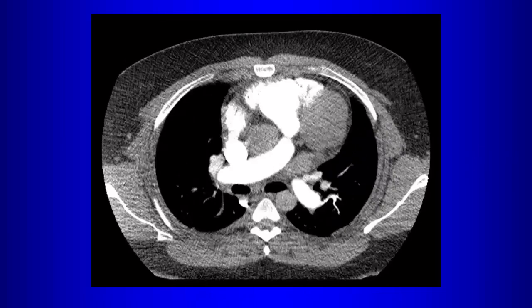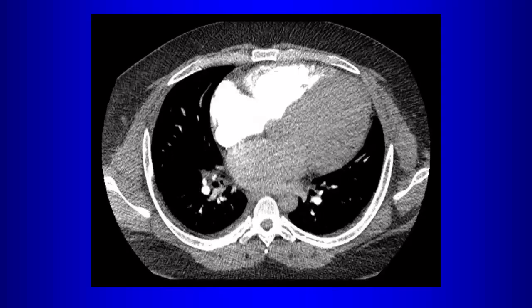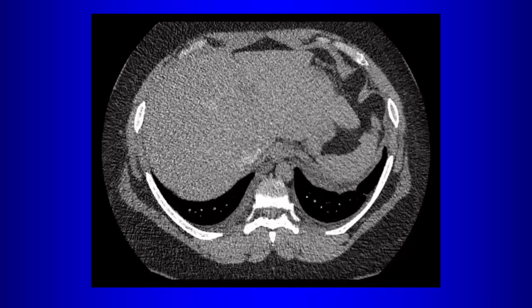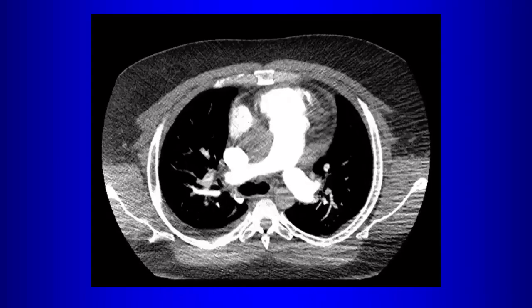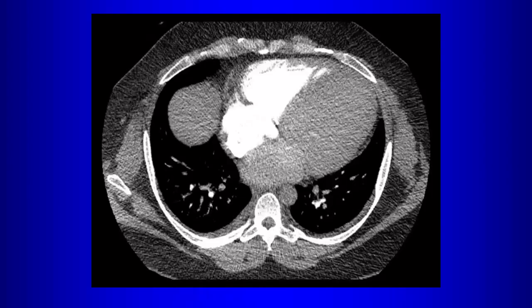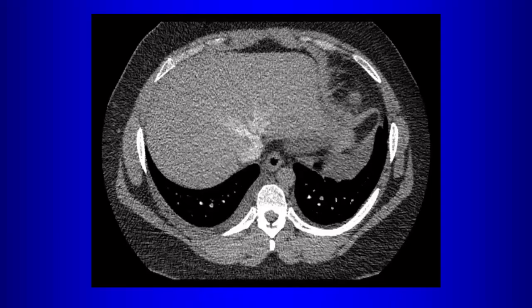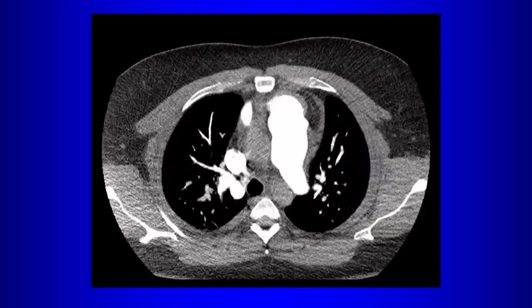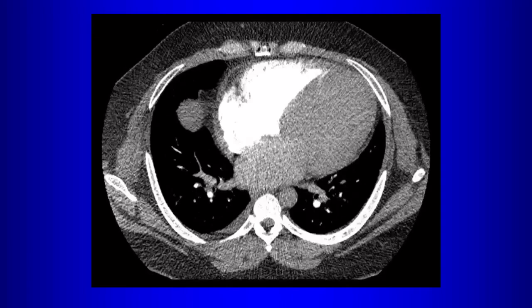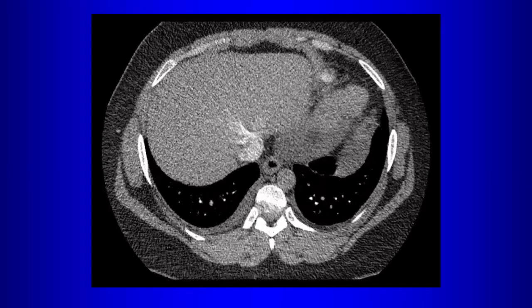Smart prep. So how does it work? You select a vessel of interest. That's how you differentiate when you're going to time the scan for PE, for looking at the pulmonary arteries versus the aorta. If you want to look at the aorta, you put your region of interest over the aorta, if you're doing an arterial phase scan. If you're doing it for the pulmonary artery, you put your region of interest over the pulmonary artery. Okay? And then how does the scanner know when to scan?